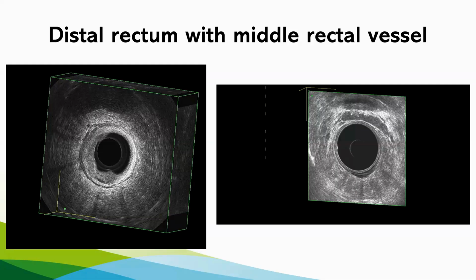It's good to have that understanding because it gives clarity to the technology. Generally, these are all tools in the surgeon's armamentarium, like for the anal, comparing it to EUA gives it clarity. It is less invasive and less traumatic, and then what the literature has regarding that comparison. And then for rectal cancer staging, where MRI is the gold standard for imaging, it will be interesting to know that from you firsthand in this presentation, what the advantages and disadvantages are.